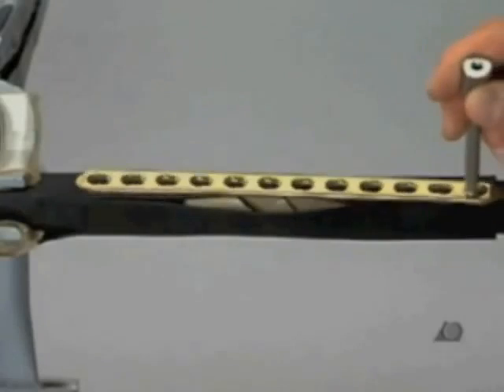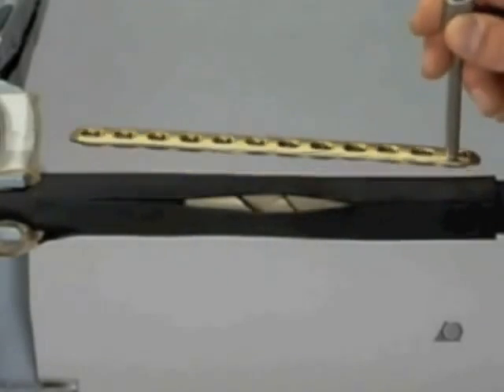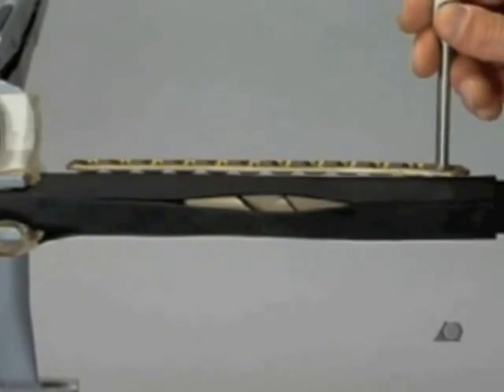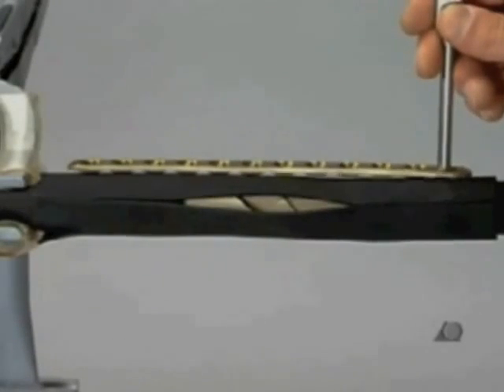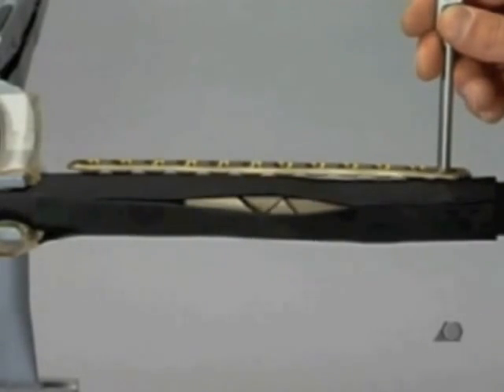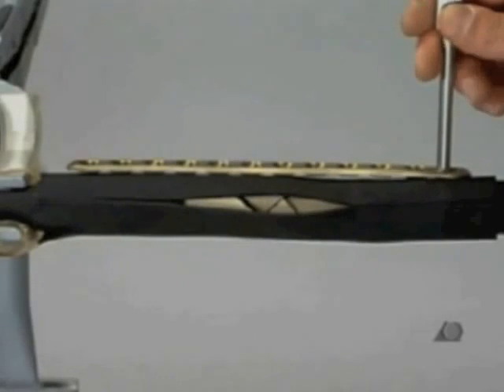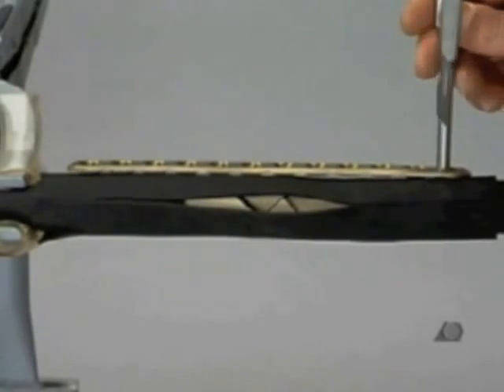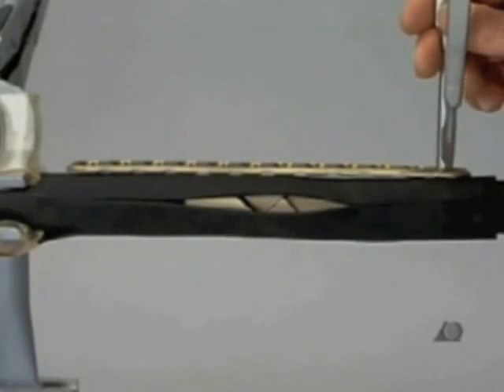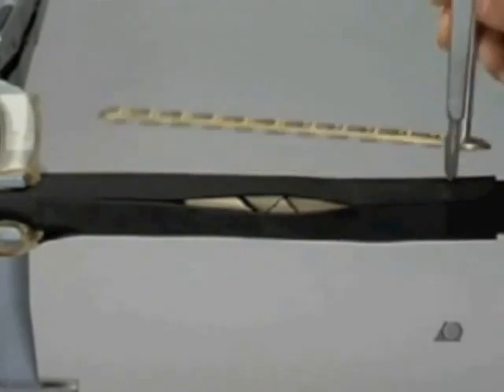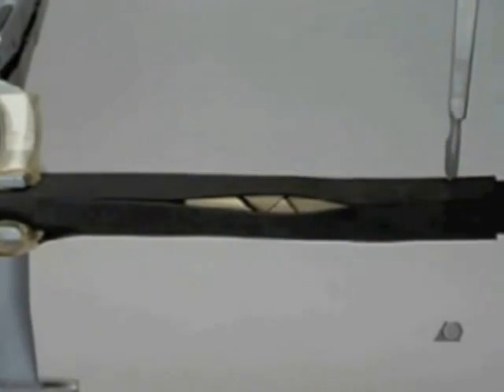The 12-hole LCP will be used to bridge the fracture. The plate is held against the bone with the LCP drill sleeve. The required position is adjusted using the image intensifier. At one end, a small incision is made down to the periosteum.